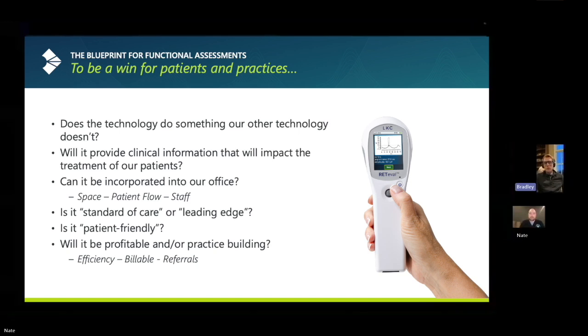Our staff know that if a patient is diabetic or has any diabetic diagnosis in the chart, they're getting it done, right? They're not asking me if they need it. They're not asking for the test. They're having it done before I come into the exam room. If they have macular pathologies or other nonspecific conditions, they're getting a Flicker 16. And glaucoma suspect is a little bit more tricky just based on diagnoses. But your bread and butters in terms of your automatic protocols are your diabetic patients or retinal vascular pathologies.